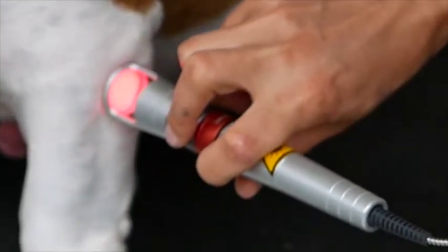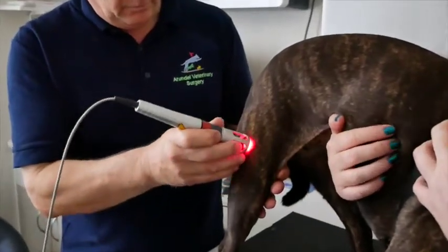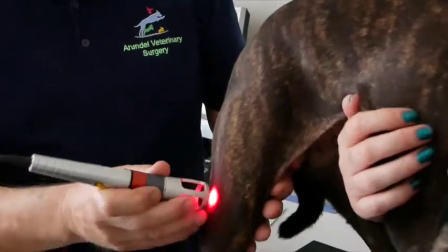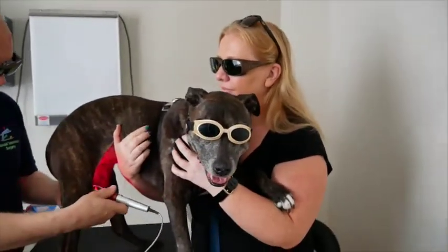Post-operative orthopedic surgeries we use it routinely now. I don't even give people the option of whether we do or we don't, because it just makes such a difference to the speed of healing. We will typically start that 2 or 3 days after the surgery, and then we will do a course of 5, and the anti-inflammatory effects.